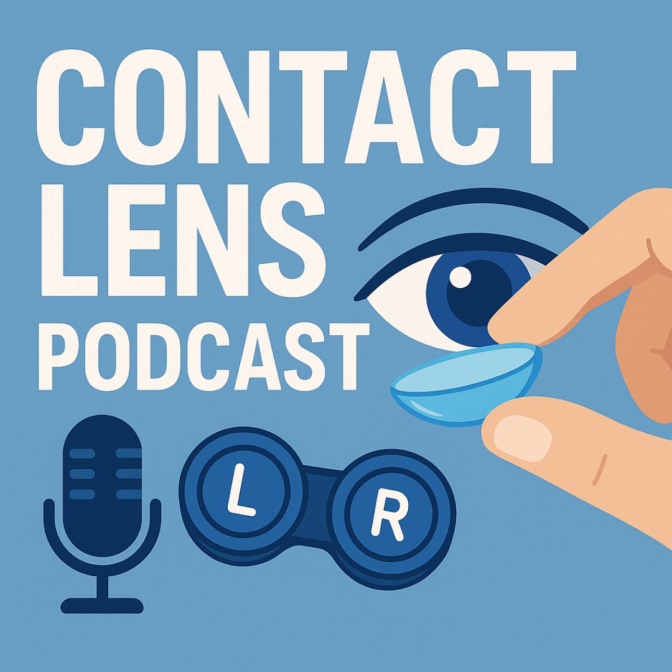Okay, so we've got distance covered, astigmatism covered. What about needing help up close? The my arms aren't long enough issue. That's presbyopia, and that's where multifocal lenses come in. These are pretty amazing, actually. How do they work? They have different zones or powers built right into the lens.